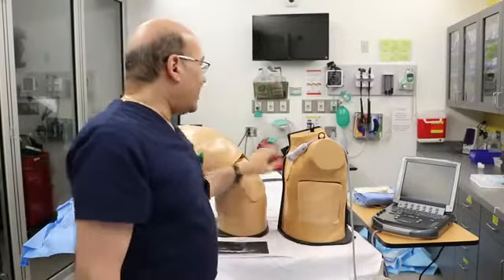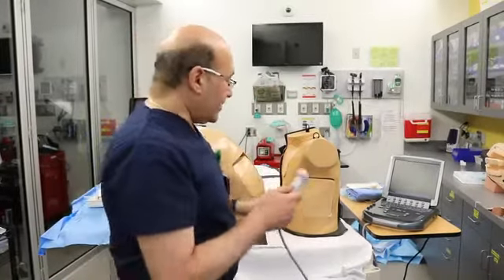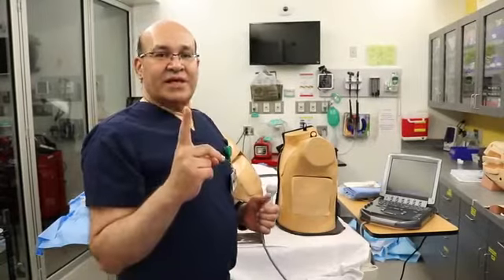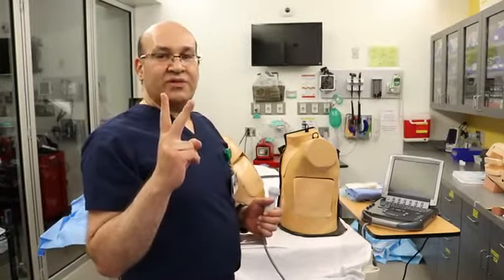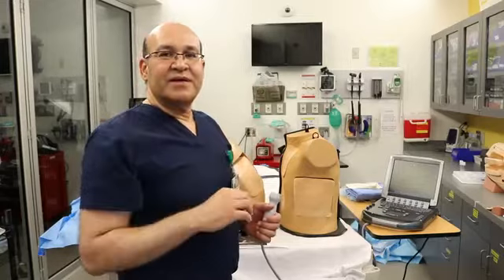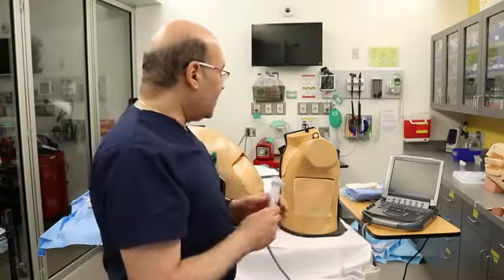Let me show you on the mannequin, and now you will concentrate on the screen. This is my probe. Ultrasound likes two things. One is a lot of gel. Two is perpendicular to the organ that you are looking at. It doesn't like two things, bone and air. So if you have air, you will see the screen very unclear. If you have bone in the way, you will see the bone shadow. And this is what we will see here.